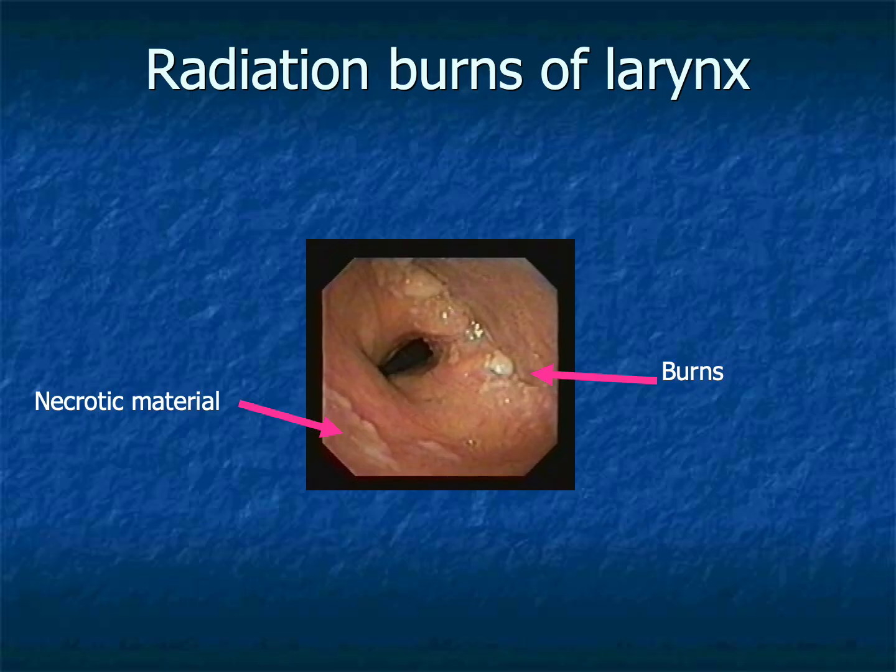These findings represent radiation injury involving the larynx. Necrotic tissue and mucosal burns may appear months after treatment. In some patients, the distinction between recurrent malignancy and post-treatment injury becomes difficult. Bronchoscopy frequently confronts us with the unintended consequences of therapies that were themselves necessary. Modern medicine often operates within these tensions. Treatment may relieve suffering while simultaneously creating new forms of injury.